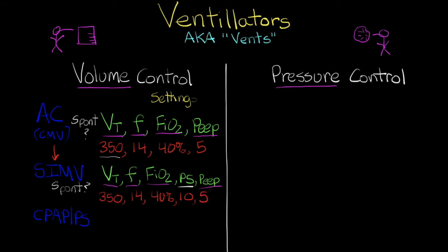But like I said, with this particular mode, it isn't truly a volume control mode of ventilation. And the reason for that is when we look at the settings here, we're not actually going to be delivering any volume of air to the patient.